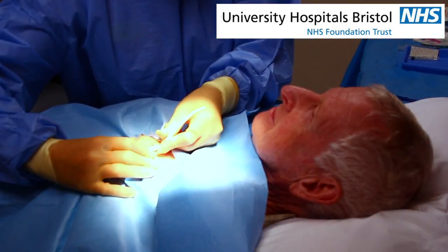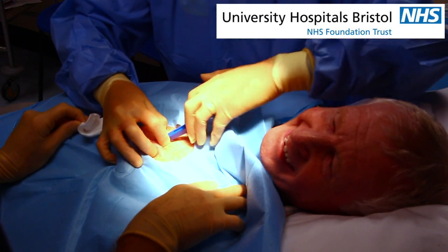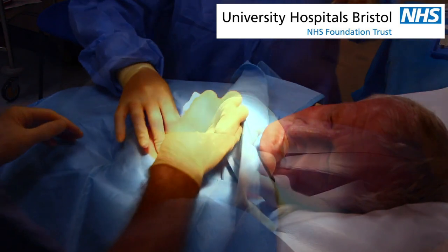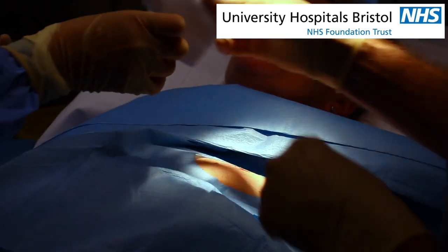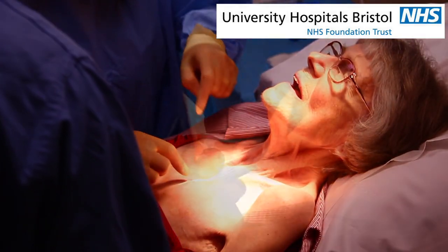A small cut will be made and the cardiac monitor will be inserted underneath the skin of your chest. You will feel the pressure of the device being inserted, but it will not be painful. In the majority of people, the device will not be visible. Once the device has been inserted, a very thin plaster called a Steri-Strip and a transparent dressing will be put over the wound.